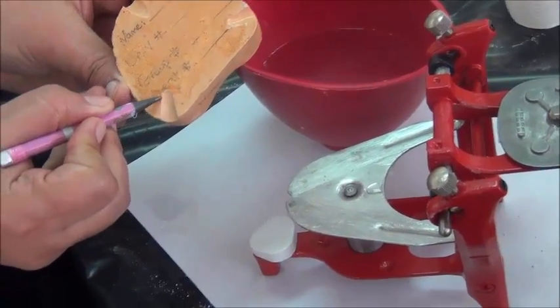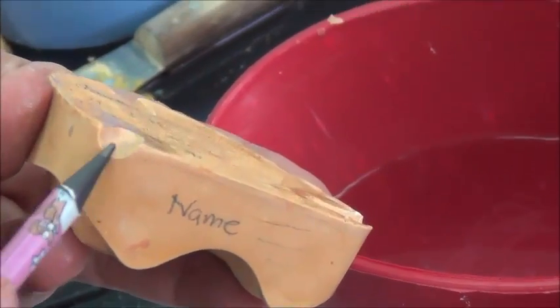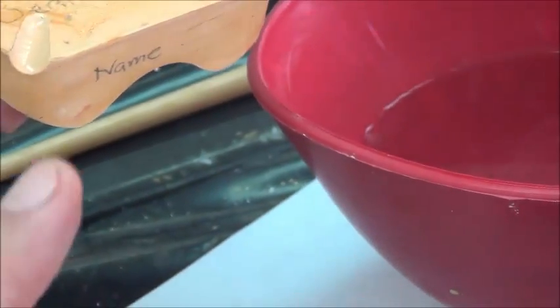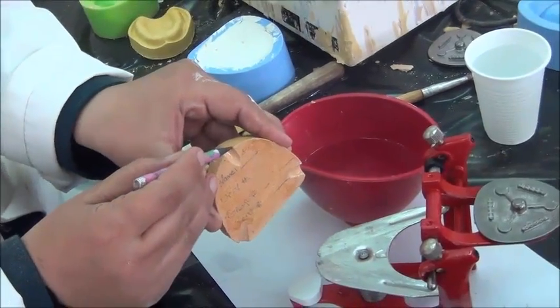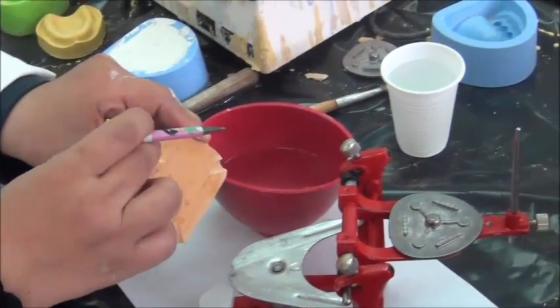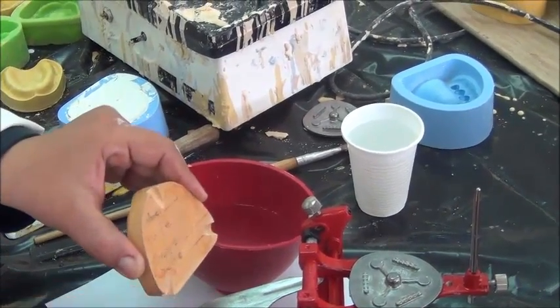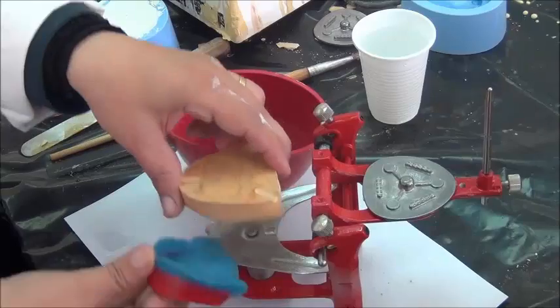The function of these notches that we created in the soft base are orientation notches. Later on in the procedure where we're doing dentures, we will have to take and separate the denture from the plaster mounting and then put it back and reorient it. So these indentations will be met by the plaster by positive indentations going in. So if we take those two parts apart and put them back, we can easily reorient them. We'll see it in the final product. So we're going back with the wax rim in place.